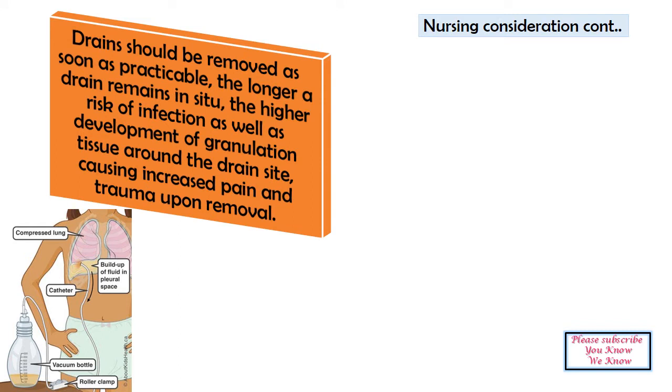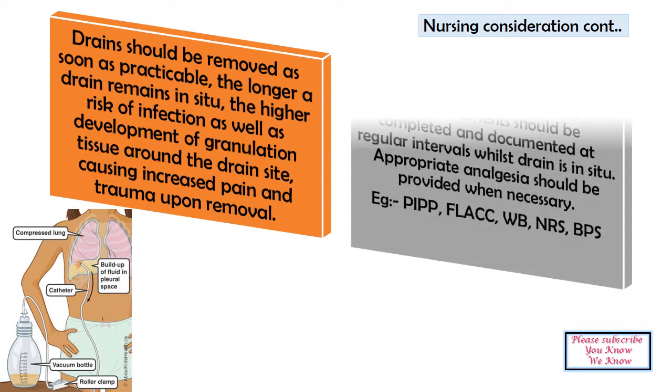Drains should be removed as soon as practicable. The longer a drain remains in situ, the higher the risk of infection, as well as development of granulation tissue around the drain site, causing increased pain and trauma upon removal.